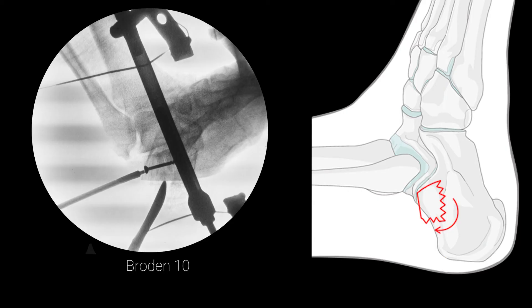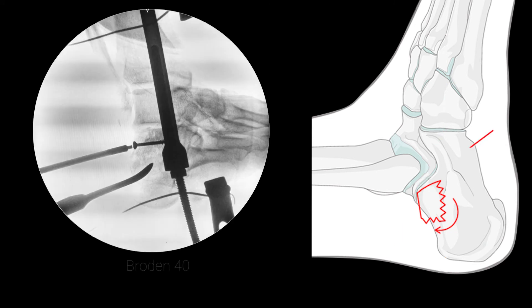At one angle, the articular surface can appear smooth, but another angle reveals a step-off because of irregular reduction of the fragment.